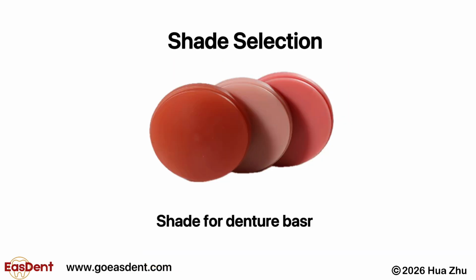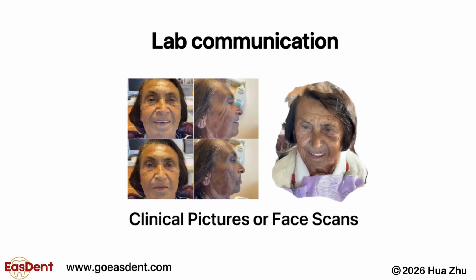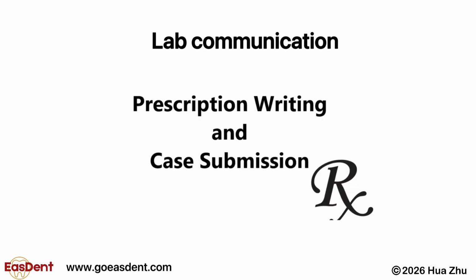Denture bases are available in multiple shades. Most patients have no preference. Standard pink is typically selected by the lab and is generally well accepted. Always provide all required photographs or face scans along with a clear written prescription to the lab to ensure accurate aesthetic replication.